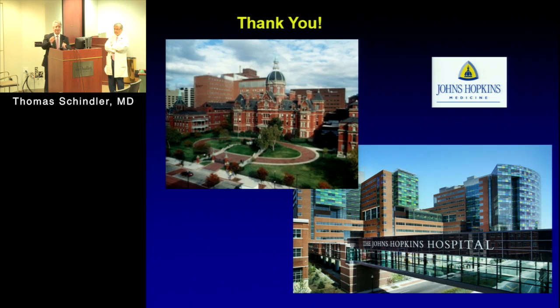So now you have a wall thickness of 10-12 millimeters. You have now myocardial infarction, let's assume 4 millimeters. Now you have edema added, acknowledged by the MRI community, up to 20-25%, but in acute setting probably even more. Then you have a delayed enhancement over 7-8 millimeters. Then of course the whole wall is lighting up with delayed enhancement. You think it's transmural necrosis.